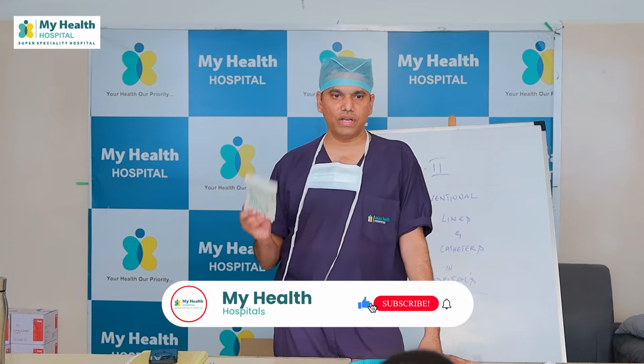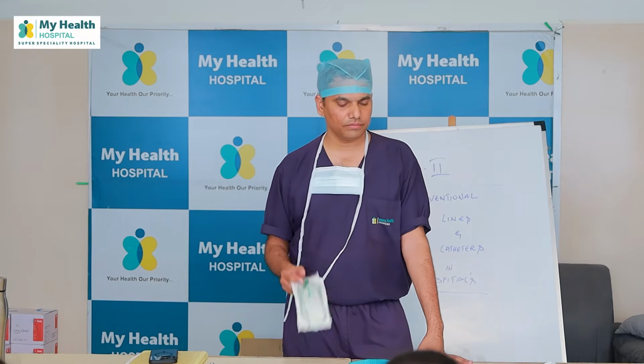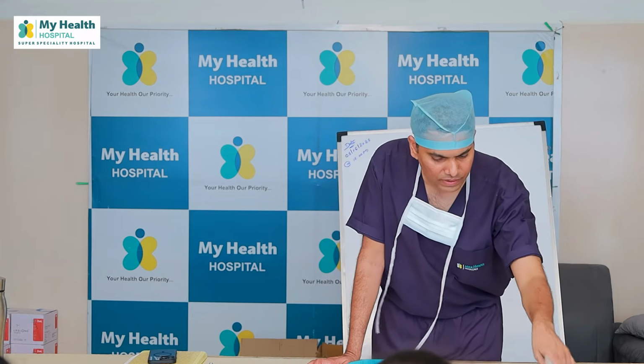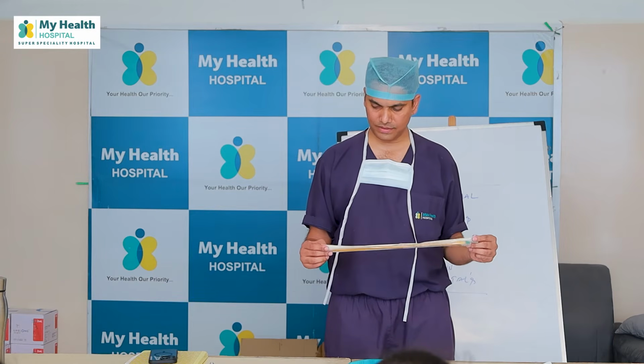If you are placing a Ryle's tube, unless it is said to be clamped, do not clamp a Ryle's tube. Okay, done. Now that we have come to Ryle's tube, the most common thing that we encounter is Foley's catheter.